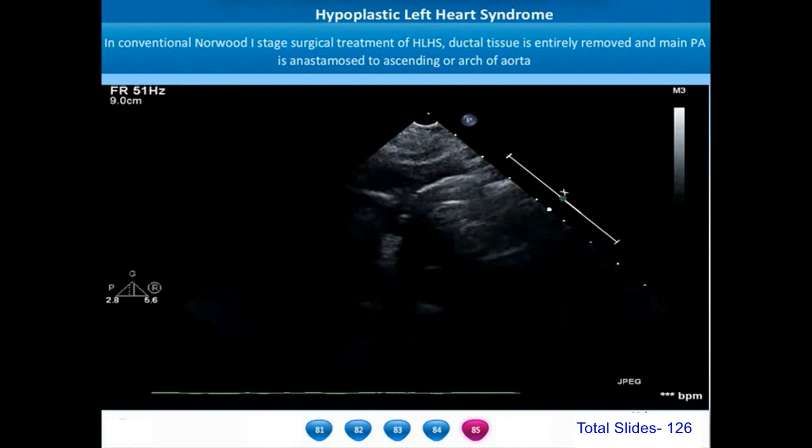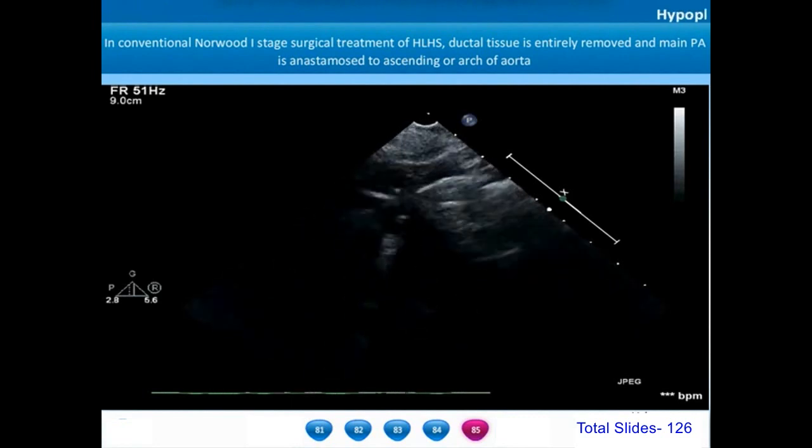Echocardiographic visualization of the entire aortic arch, the isthmic area and the postductal region should be done with meticulous care. The aortic dimensions at various levels like the transverse arch, isthmus and postductal region all will have major impact on surgical correction.